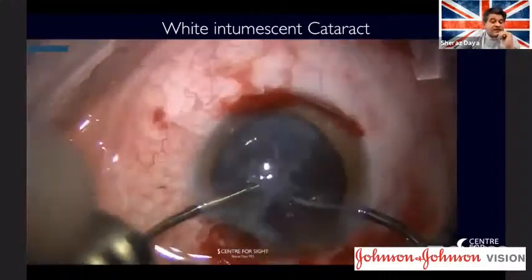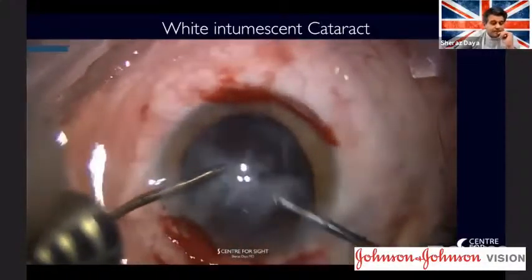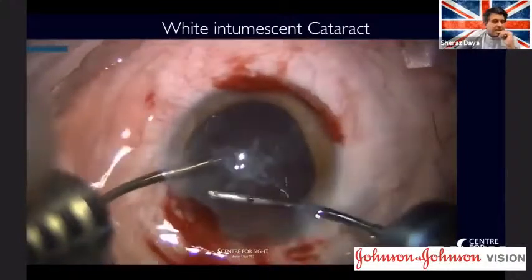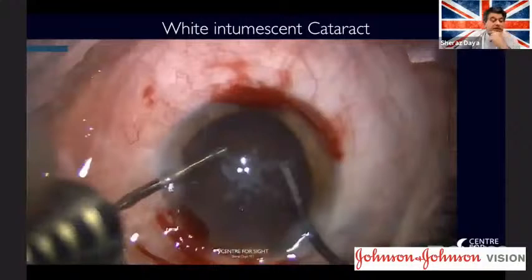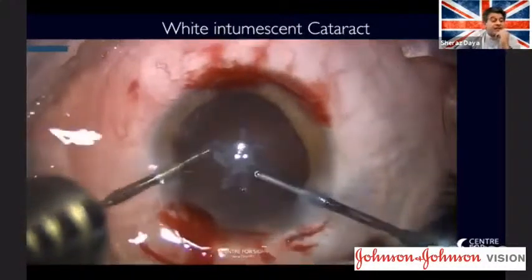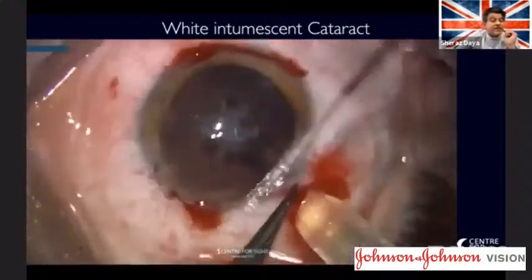You can see the anterior plaque there that had already been discussed in the symposium. Well, that was achieved without any radial tears. As you can see, the trypan blue didn't stain the capsule very much. And here I'm injecting in a trifocal lens.